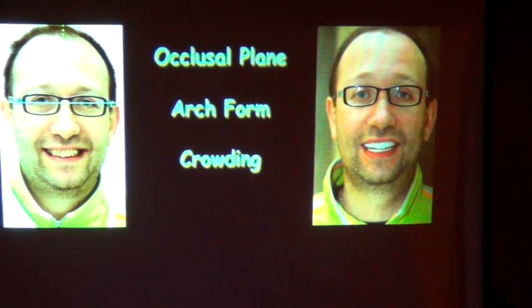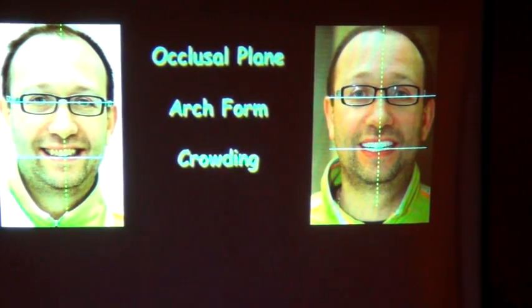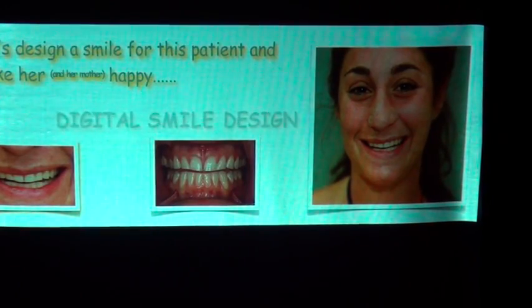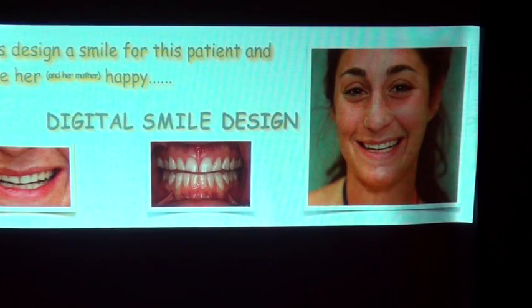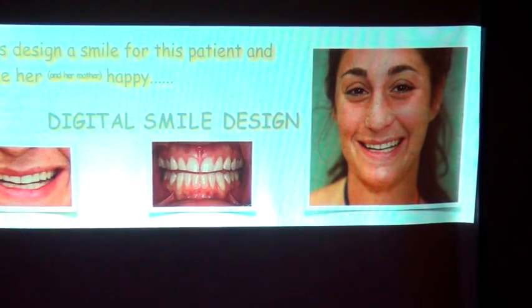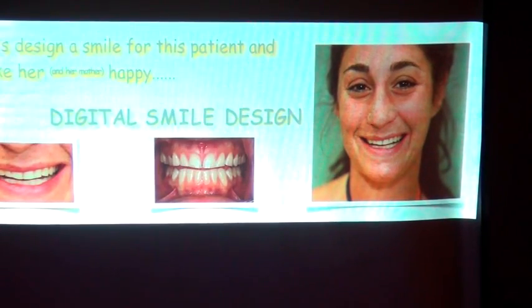So we're going to thank Bill. I'm going to show Bill what we did with a very nice patient that he referred over, and let's design this smile for this young lady, Jessica, and make her happy. Her mother came, and you have the three views we talked about: smile, intraoral, and then portrait.